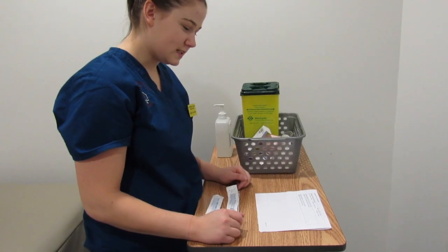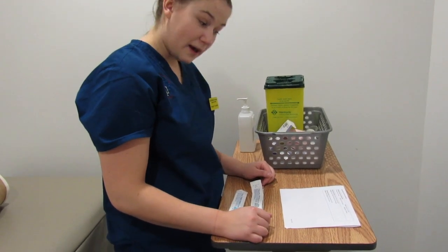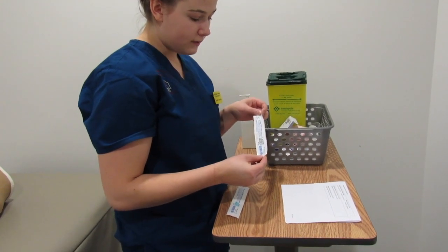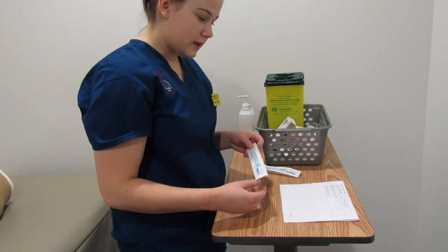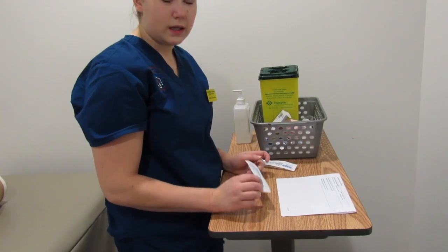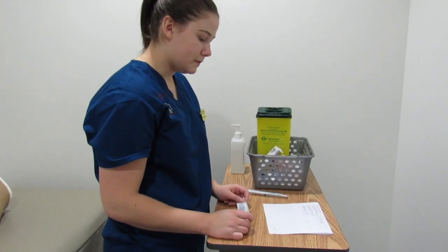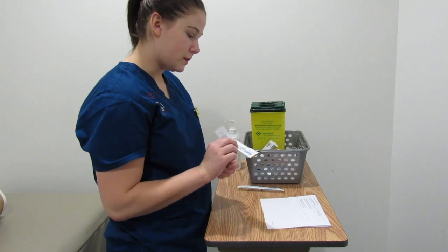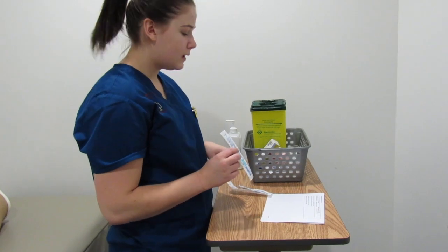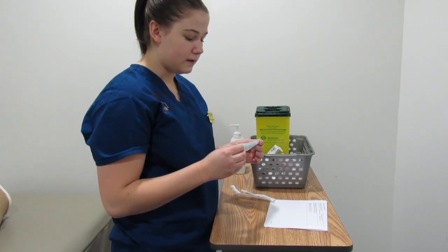So for the subcutaneous injection, it's ordered that the patient receive 5,000 units of heparin. So for the subcutaneous, I'm going to use a 27 gauge half inch needle. And for the intramuscular, it's 1 milligram intramuscular of Haldol, and I'm going to use a 23 gauge. So for the heparin, the patient will receive 1 milliliter, so I've decided to choose a 1 milliliter syringe. And for the Haldol, it's going to be 0.5 milliliters. This is the only one we have available, but I would use between 0.5 and 1 mil.